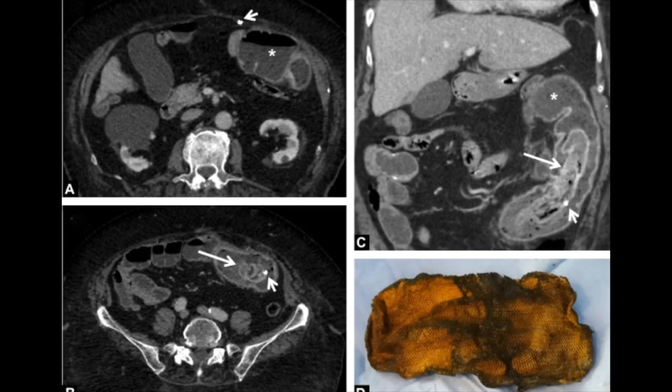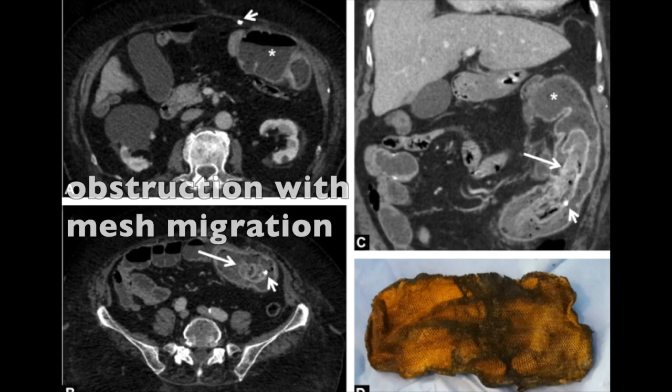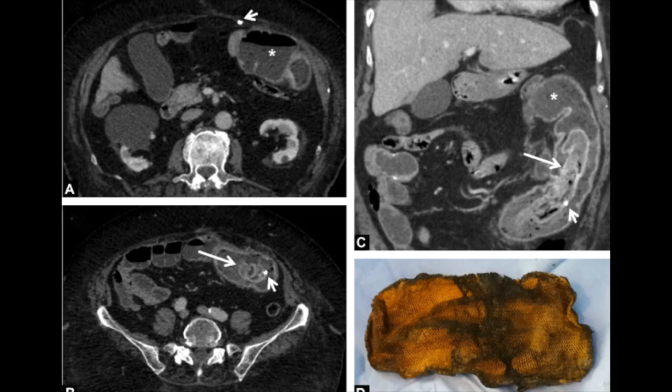Here's another small bowel obstruction. In this case, there was migration of the mesh. This patient had a prior history of colectomy and presented with abdominal pain and vomiting. Again we see dilated small bowel loops, but this time there is an intraluminal foreign body indicated by the long arrow. This foreign body was hyper-attenuating and contained a tack seen by the short arrow. Gross pathology confirmed a parietal mesh that had migrated into the small bowel.